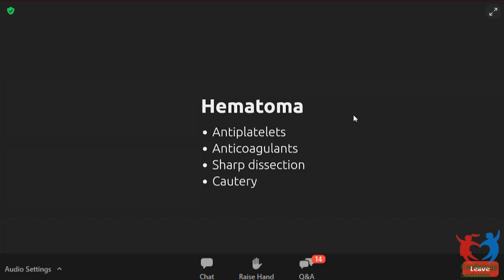But what you do each time you put in a lead, of course, is connect it to the PSA. PSA stands for Pacing System Analyzer. The Pacing System Analyzers are usually built into the programmers. Once you connect to a PSA, you have a screen where you can see electrograms recorded from the lead, and if you directly connect ECGs, you can see those too. You can see event markers, and below you can see the measurements.